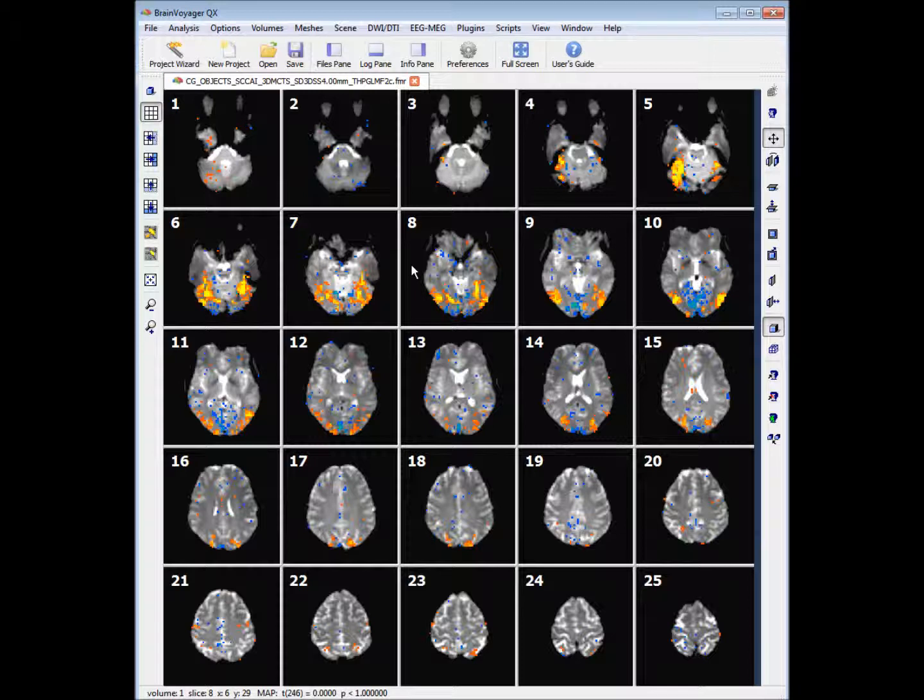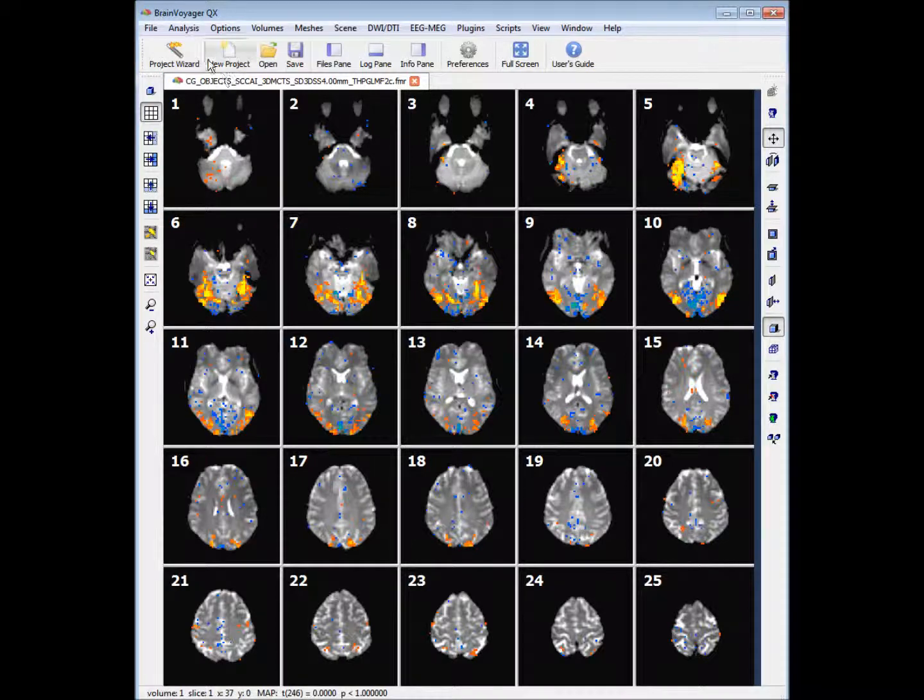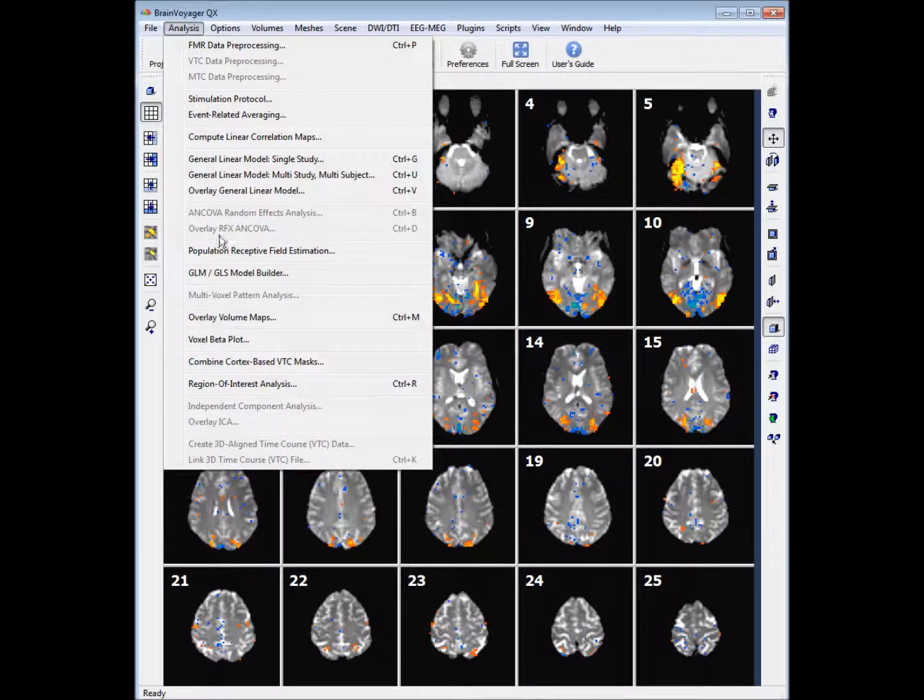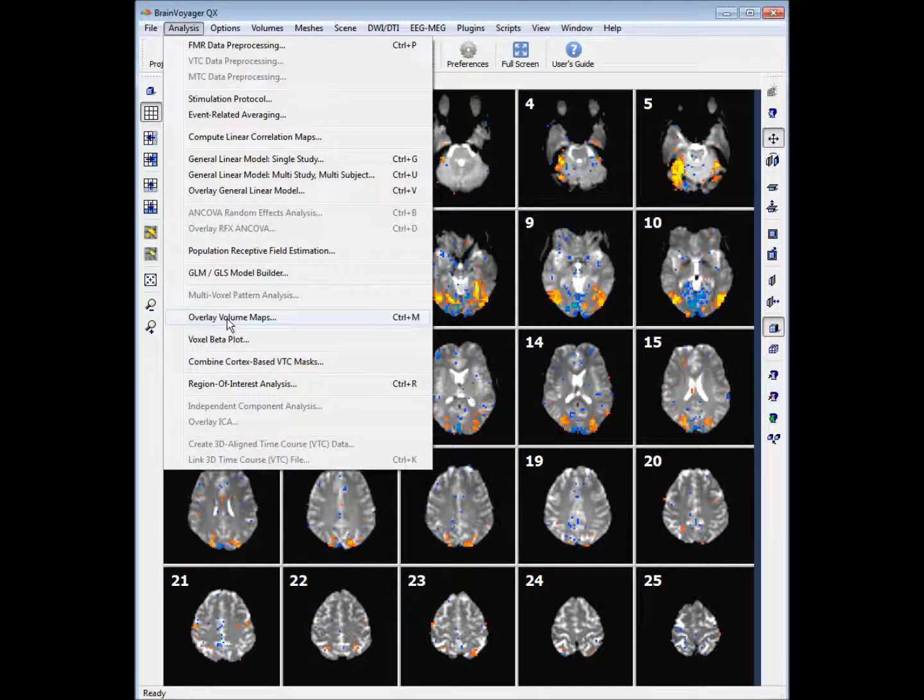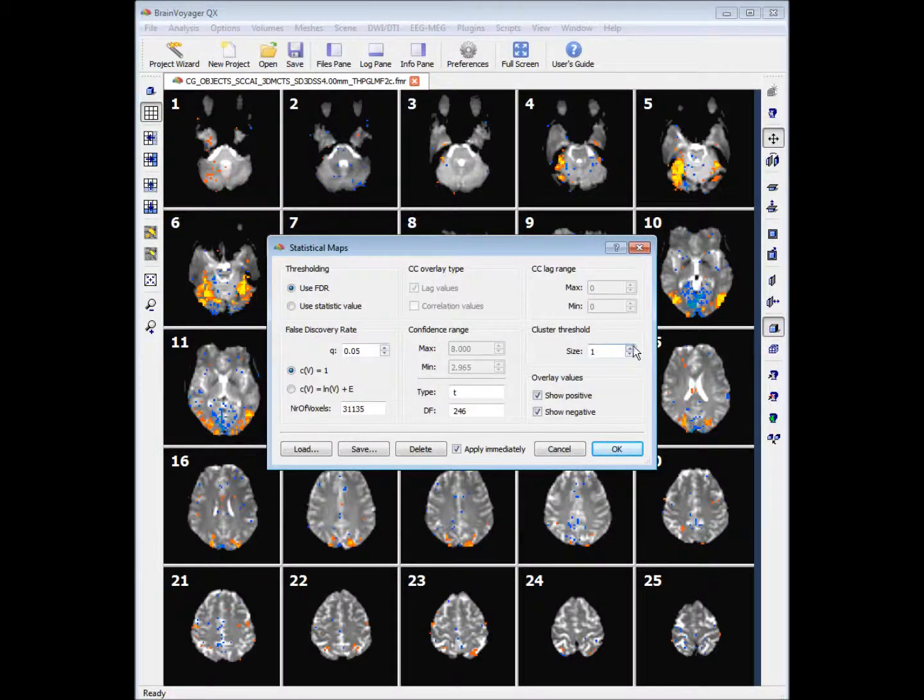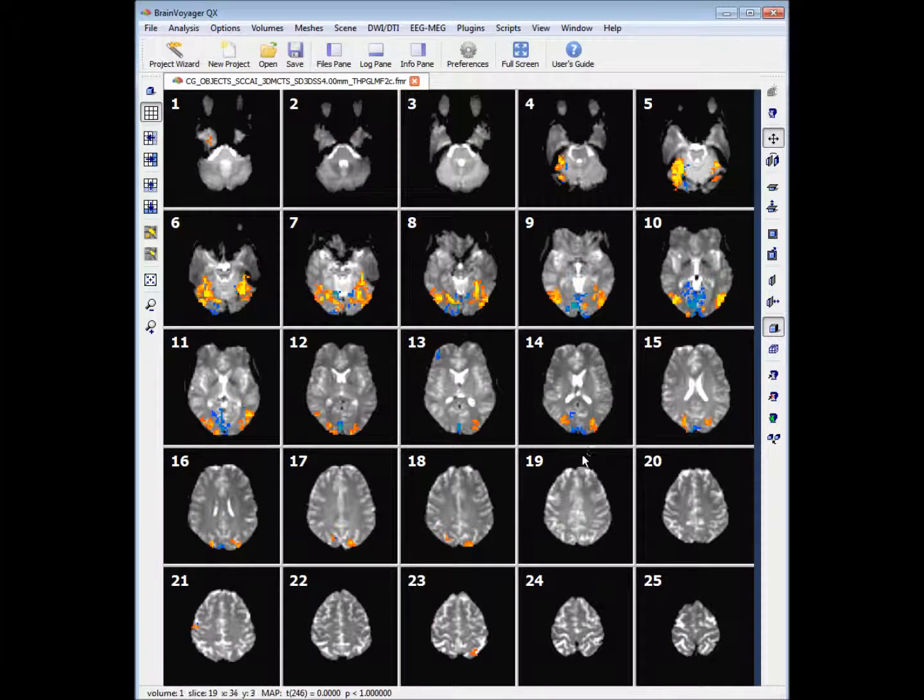Overall it's looking a bit messy so we want to change the threshold like we did in the previous step by going into analysis and overlay volume maps and changing the cluster threshold to 6. This has tidied up our data a little bit.